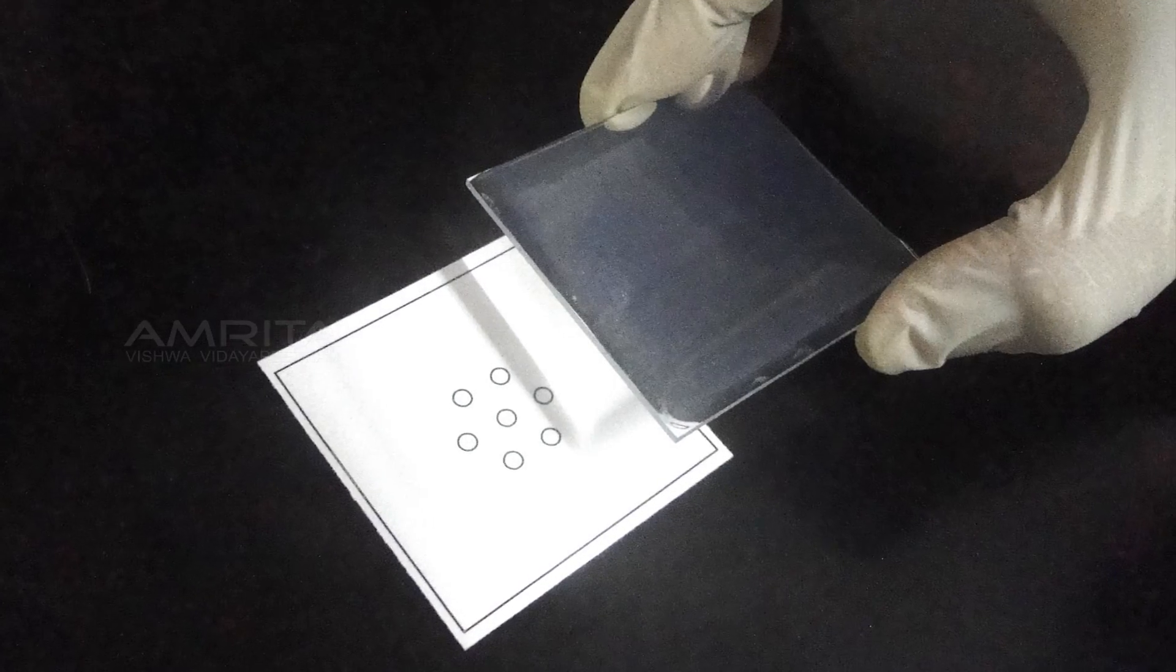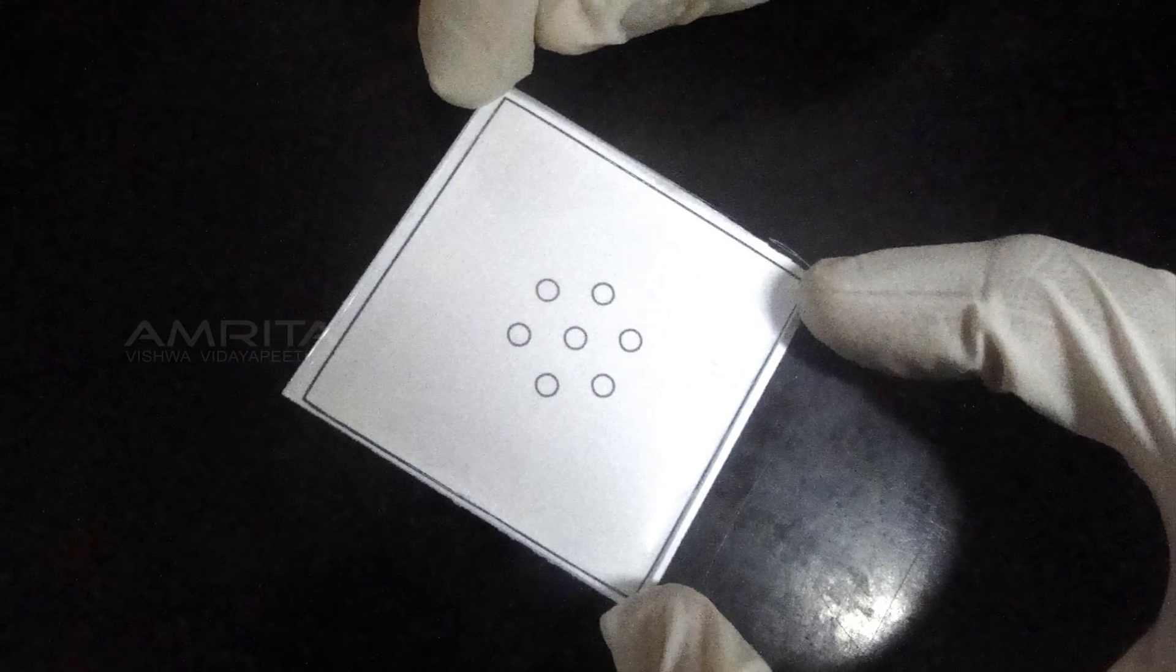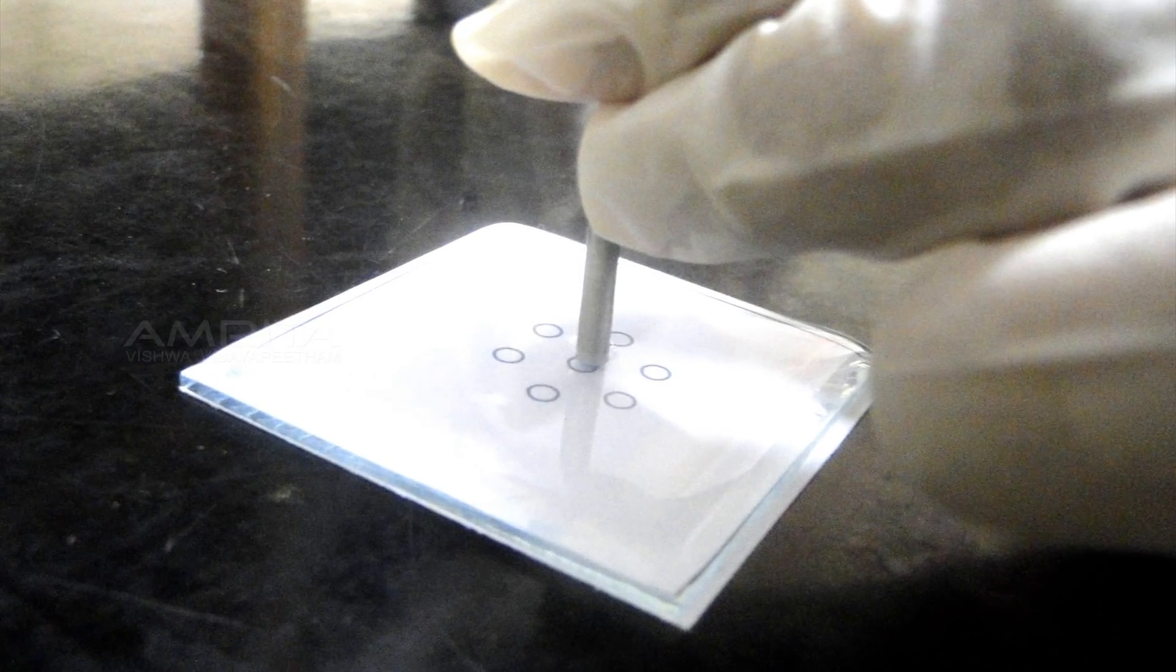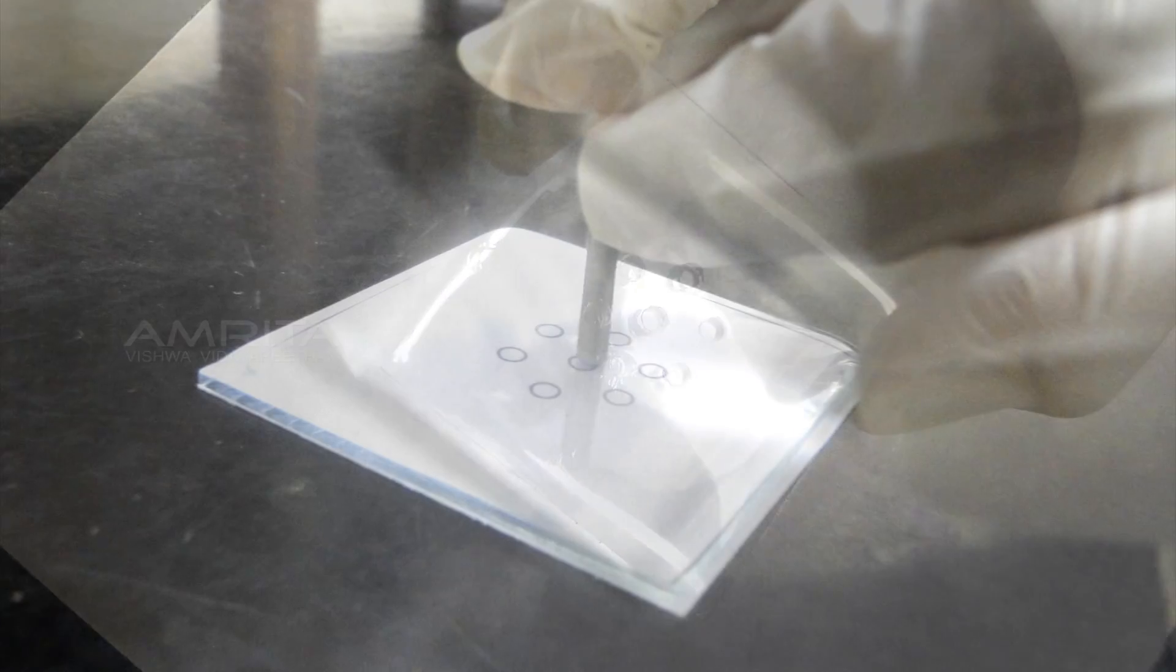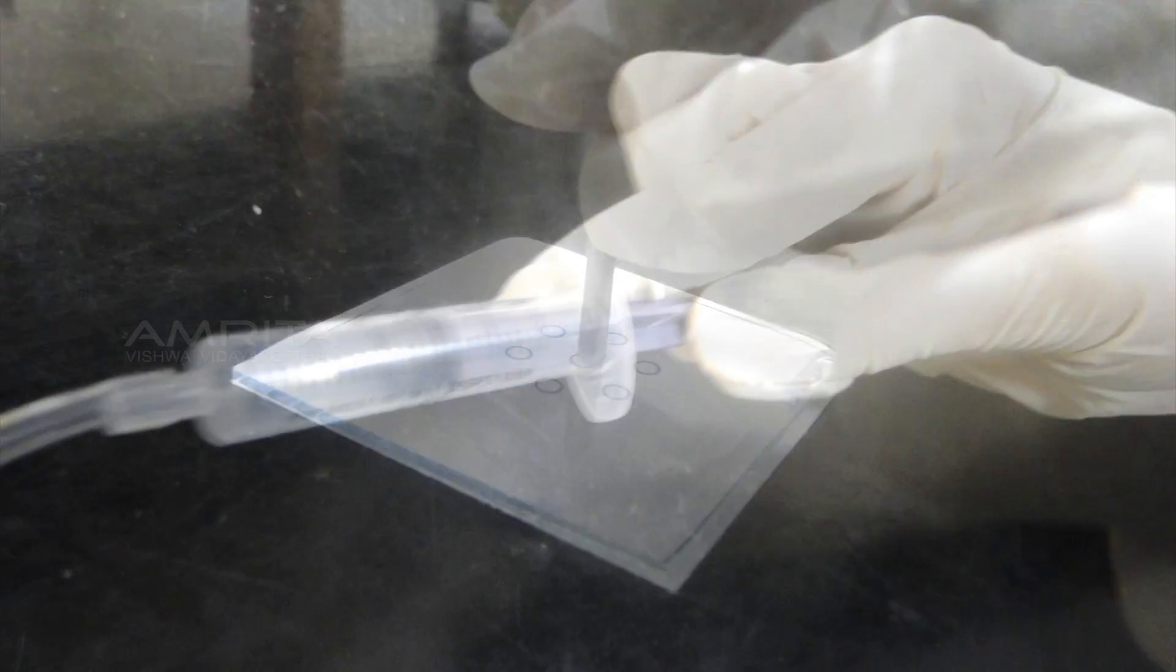Place the gel plate on the template provided. Punch wells in the gel with the help of a gel punch corresponding to the markings on the template. Use gentle suction to avoid forming defect wells.